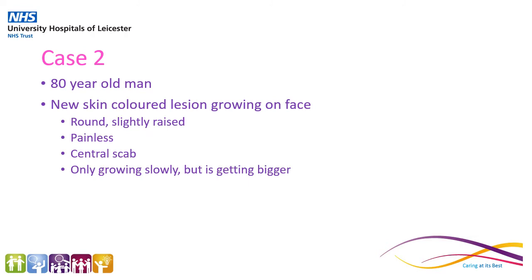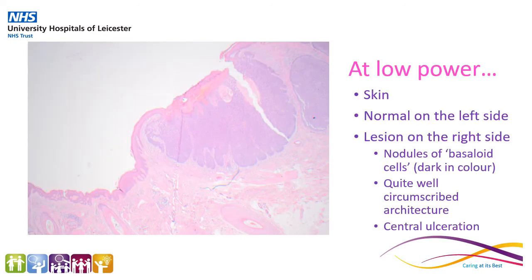The next case is an 80-year-old man with a new skin-coloured lesion growing on his face. This lesion is round and slightly raised. It's painless and it has a central scab. The lesion is growing slowly, but it is getting bigger. This man has had an excision of the lesion, and here we have a picture of it at low power. This is a section of skin, and on the left-hand side we've got the normal skin with hair follicles present, and on the right-hand side we've got our lesion.